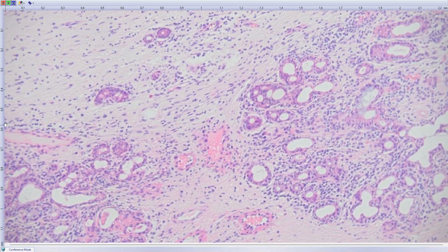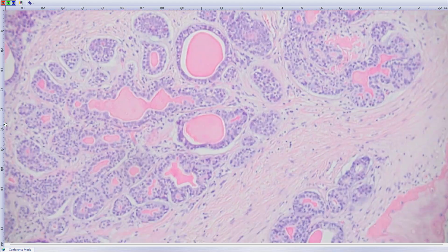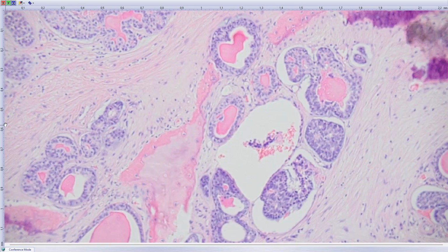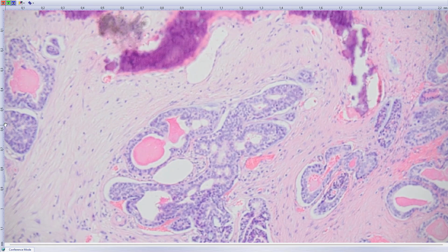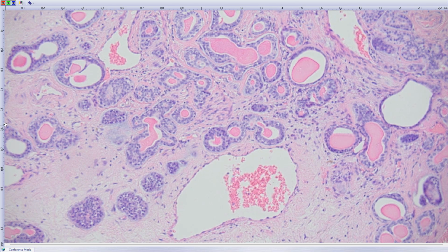And they gradually change into adenoid cystic carcinoma, like you can see here, including perineural invasion. And we think that a big part of tumors in this location has origin in seromucinous hamartomas, which differentiate into atypical forms and into malignant forms.